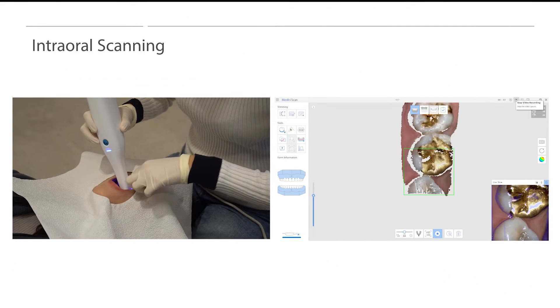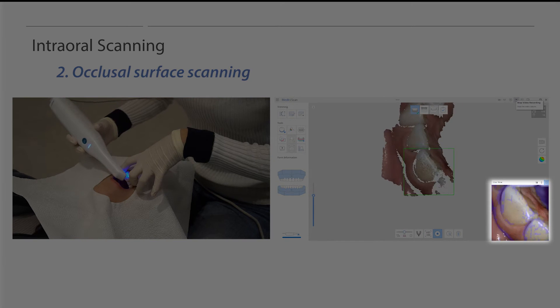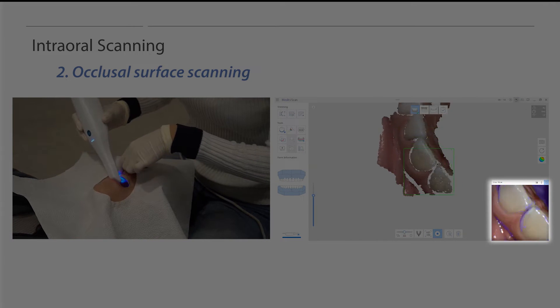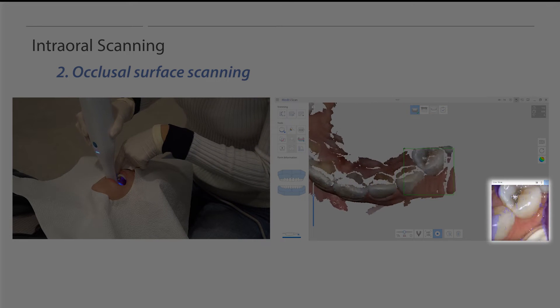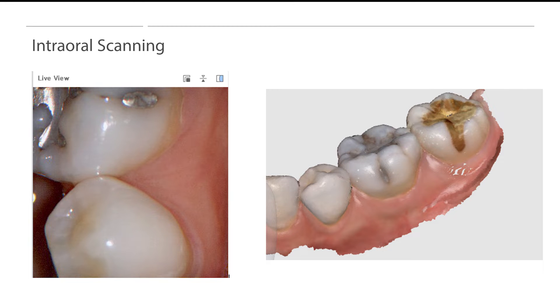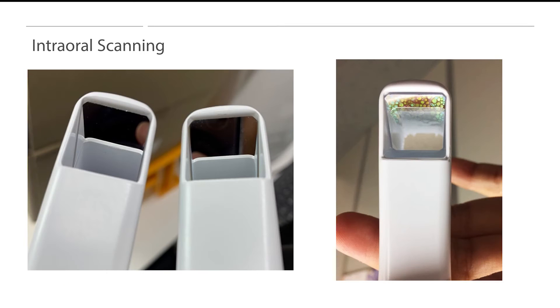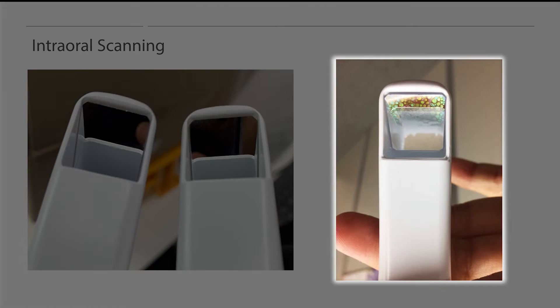Now let's scan. When scanning, it's important to look at the live view window on the bottom right-hand side. You can think of the live view as the camera's field of vision. If the live view shows clean scan data, the scanner will capture the data accurately. If you notice blue noise in the live view window, this indicates that the scanner is too far from the surface area. To avoid this, place the scanner as close as possible to the teeth or adjust the scan depth control. If the view is still unclear, you will need to check the scanner tip for watermarks or visible scratches.